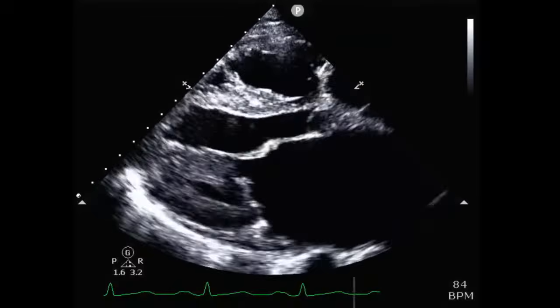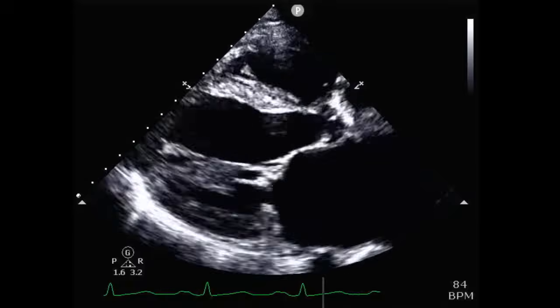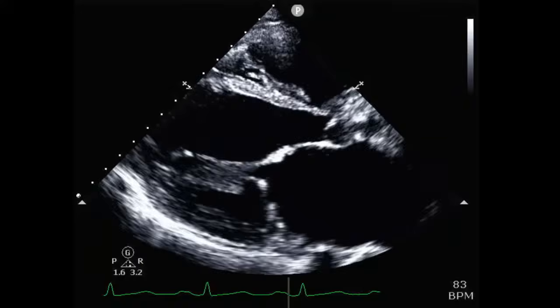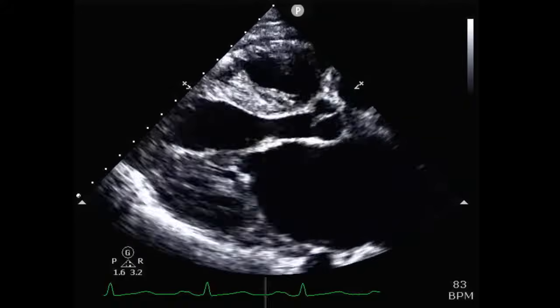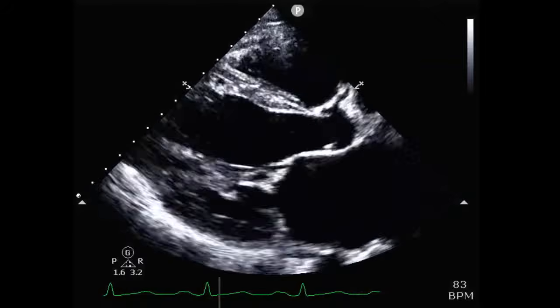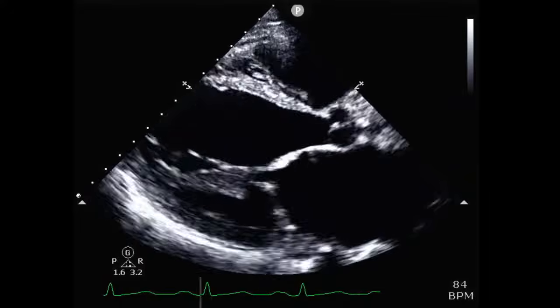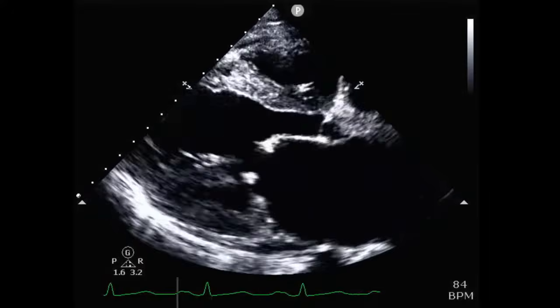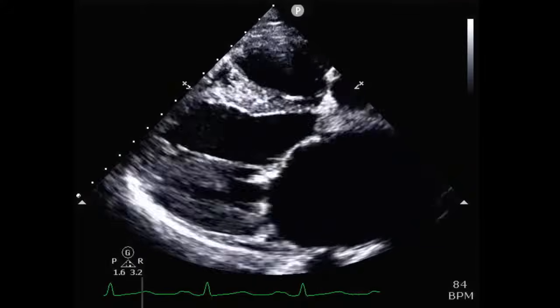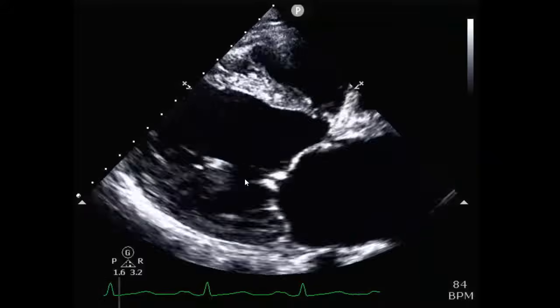Hi everyone. Today we're going to be looking at a study of a patient with a rheumatic mitral valve which exhibits both mitral stenosis and regurgitation. This is an initial parasternal long axis view of the heart, which shows a dilated ventricle and somewhat thickened mitral valve. The mitral valve thickness looks more prominent at the tips of the valve here than at the base.